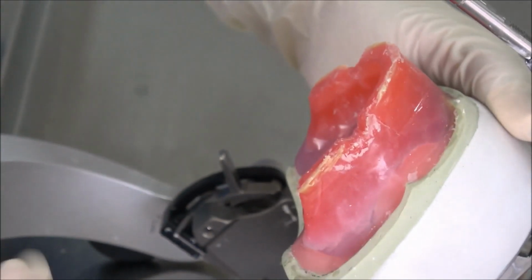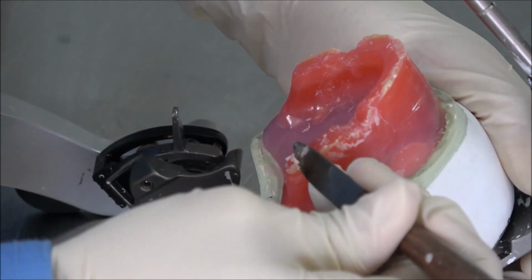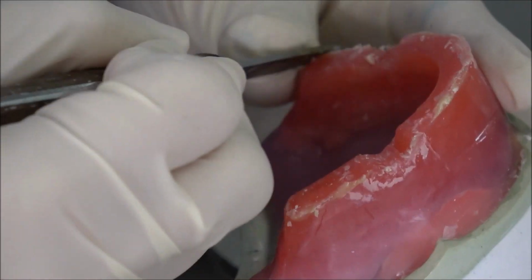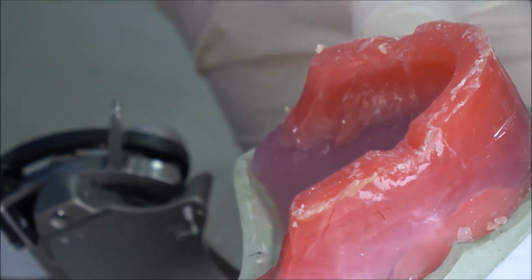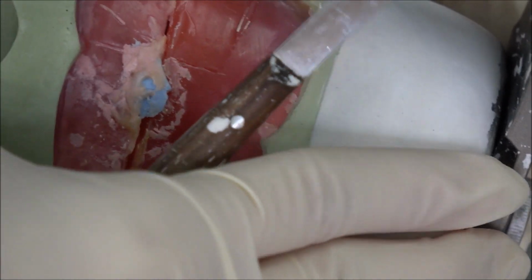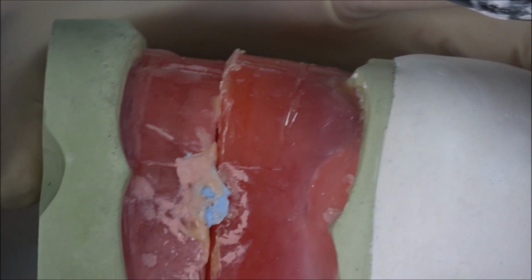Remove our sticky wax here, only then we fix it. Remove all the excess, and we fix again. Okay, so please check the bite. Once we confirm our bite is correct, we seal it.